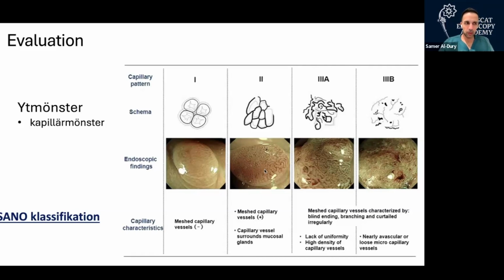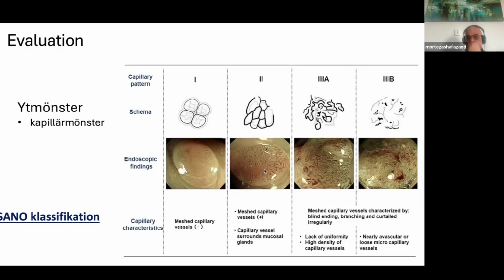When I see a polyp, I look quickly in white light, then I shift to NBI, preferably with near focus as soon as possible to look at the vessels. Sometimes I use a lot of water to basically drown it in water to get that natural enhancement, just to get a better view of the image, to be able to make a quick optical assessment, and then I would switch to white light and look at the surface.